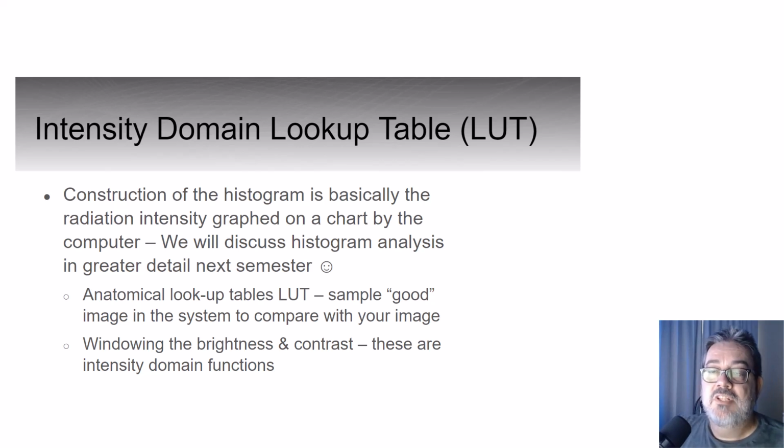First of all, changing the algorithm post-processing will remove raw data from the image set before you send it to PACS. So there's limited ability to view more anatomical detail when you do this. It's why we don't want you to window level at your workstation before sending it to PACS.